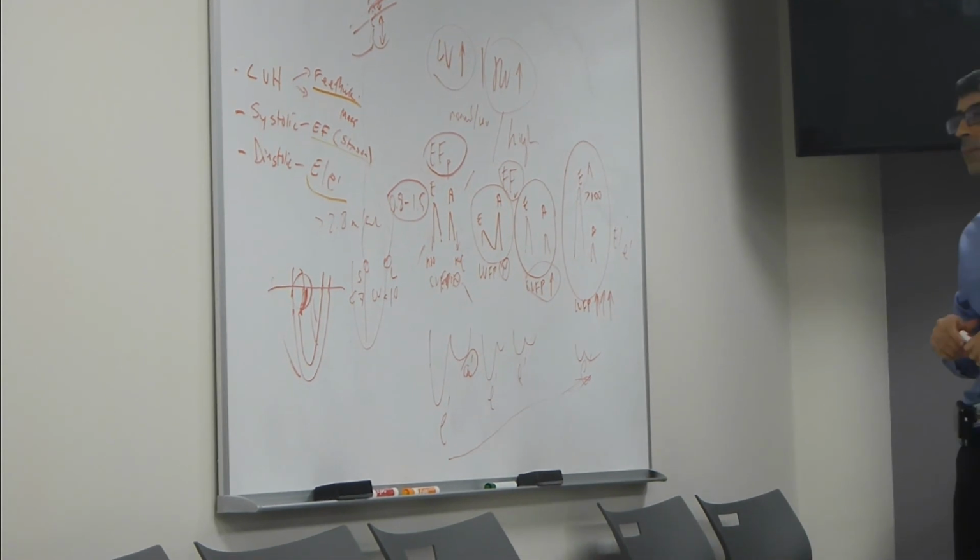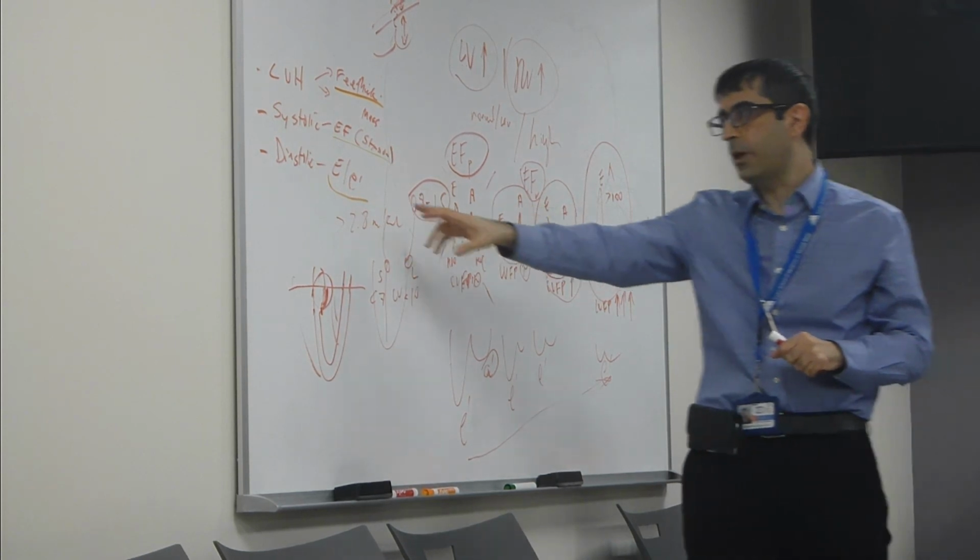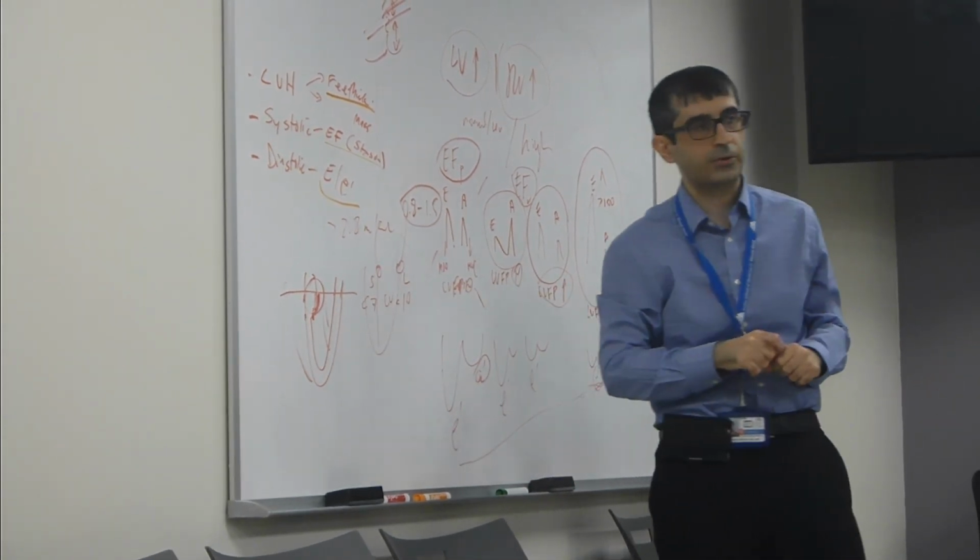Okay. And then for the E prime, I told you what the current cutoffs are.